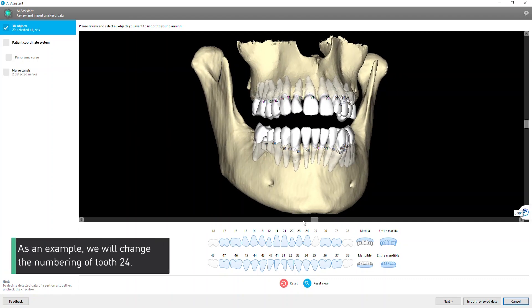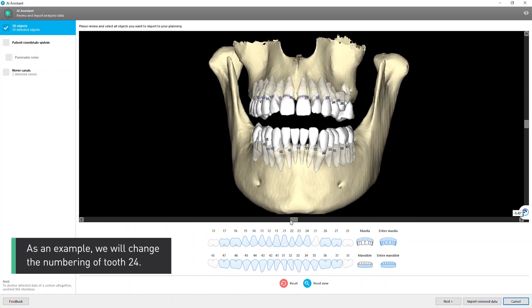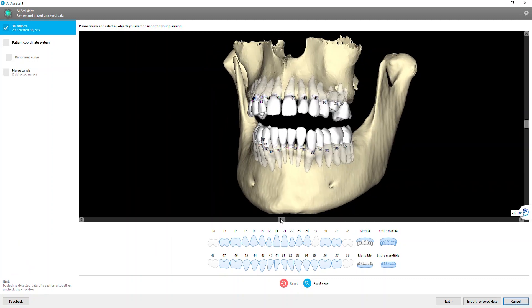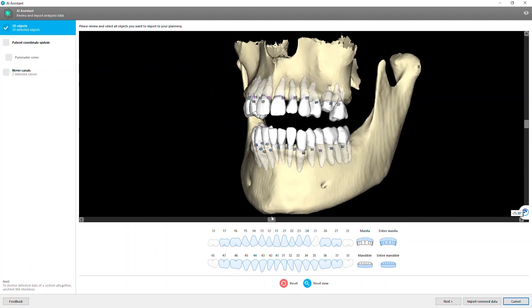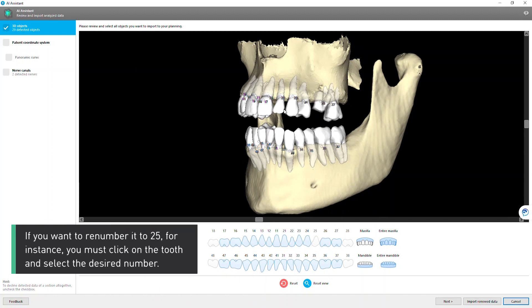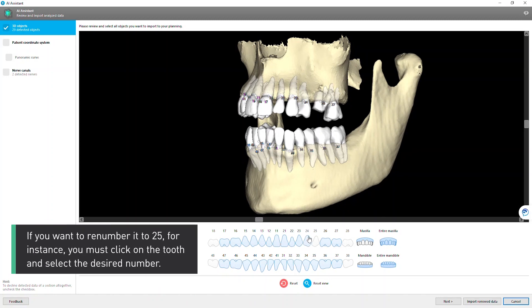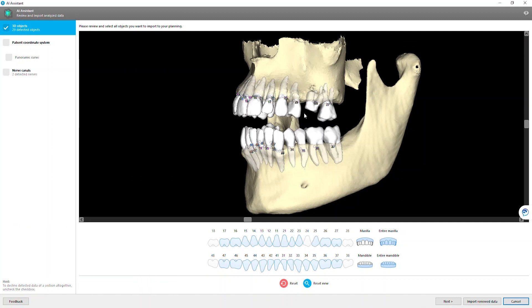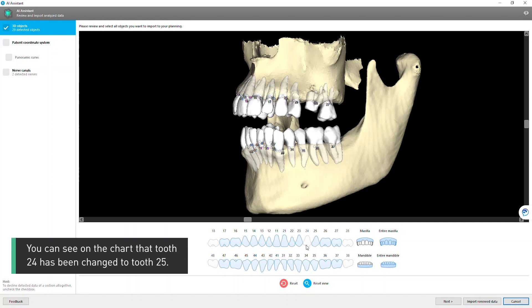As an example, we will change the numbering of tooth 24. If you want to renumber it to 25, for instance, you must click on the tooth and select the desired number. You can see on the chart that tooth 24 has been changed to tooth 25.